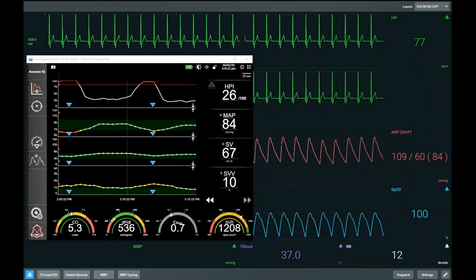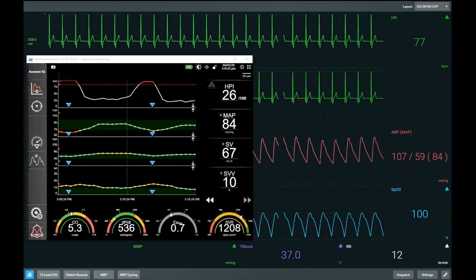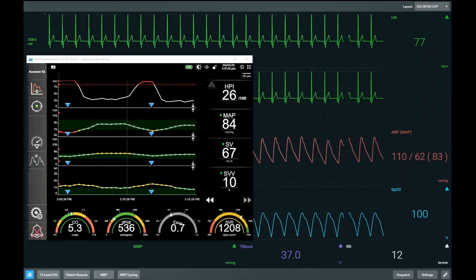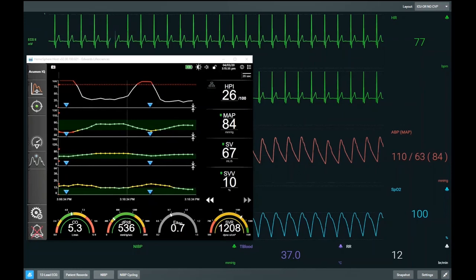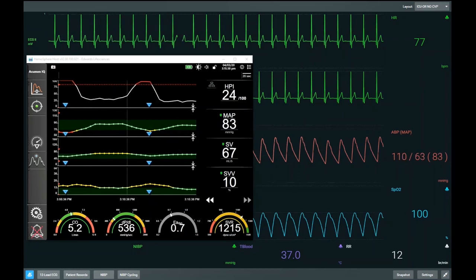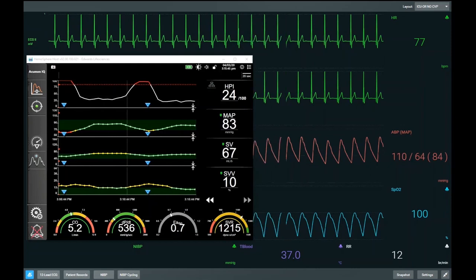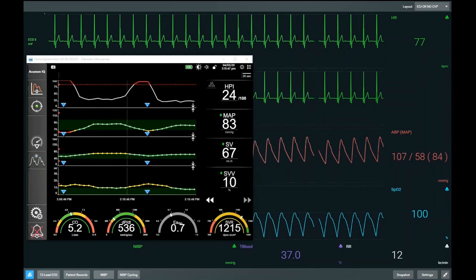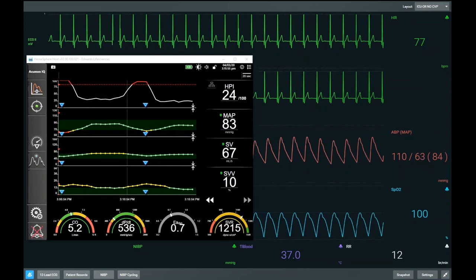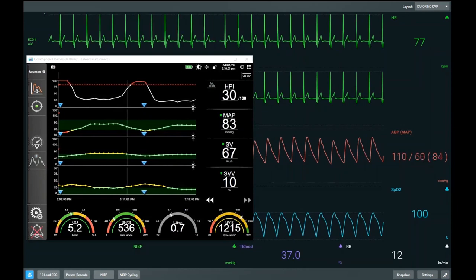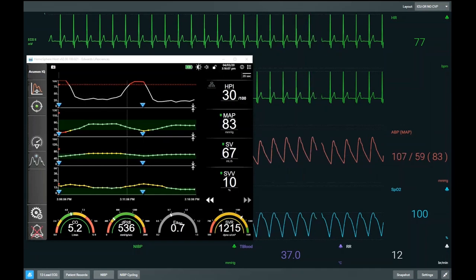We can also use Eadyne to decide whether the intervention we're about to give is the correct intervention. We can use Eadyne not only to tell us whether giving fluid will increase blood pressure, but also to see whether giving fluid will have no effect on blood pressure — thereby stopping us from giving an intervention that doesn't have the desired effect.